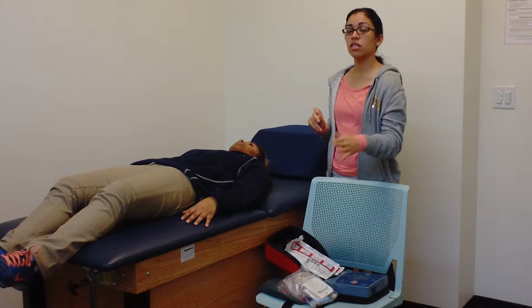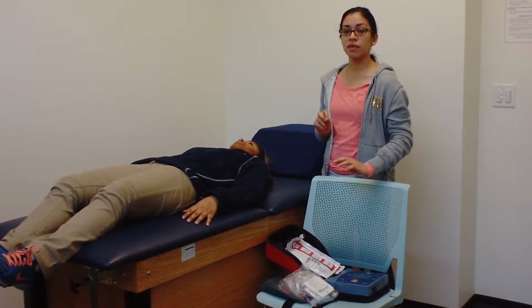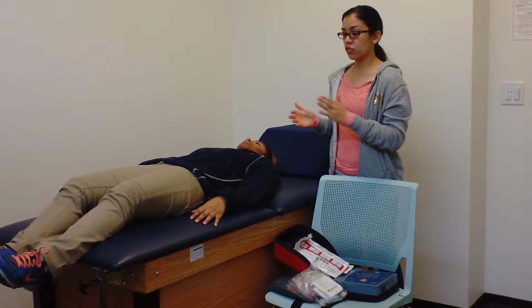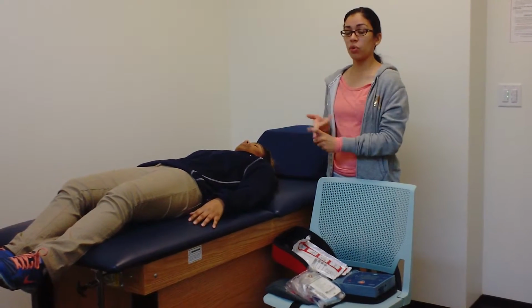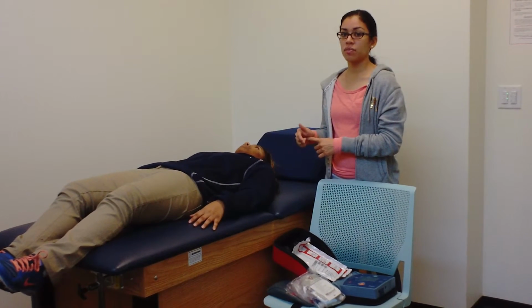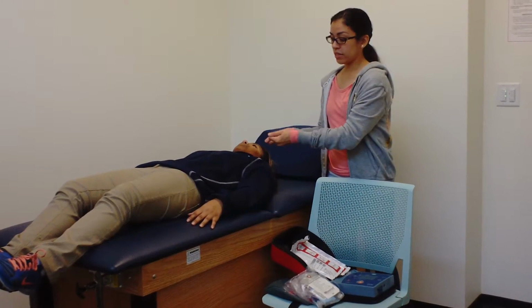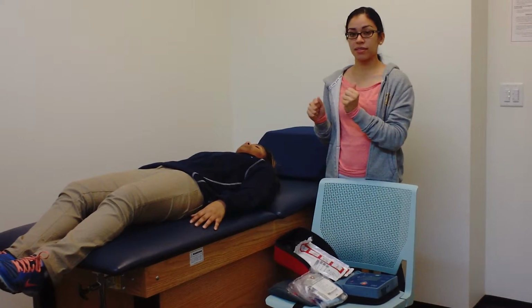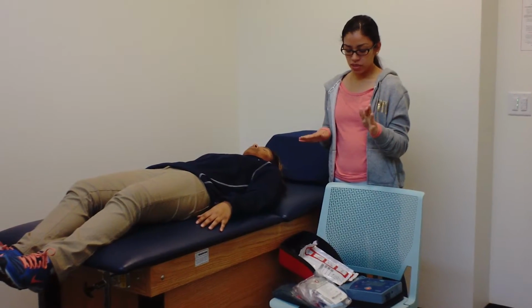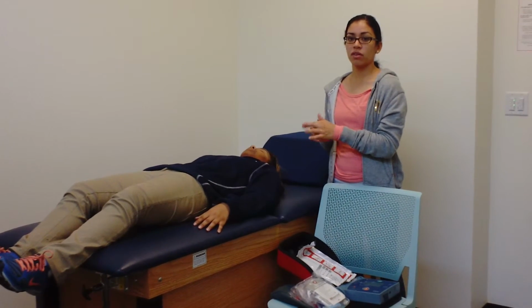This process is going to continue until the machine, the voice prompt, tells me that no shock needs to be delivered anymore. Once I have assumed that the patient has a pulse again and is breathing appropriately, I'm going to stay with the patient until emergency medical services arrive. Now, I will also stop and take off the pads if the patient starts moving or is responsive. I'm going to continue this and try to keep them calm and let them know what has been done and wait until EMS services arrive.